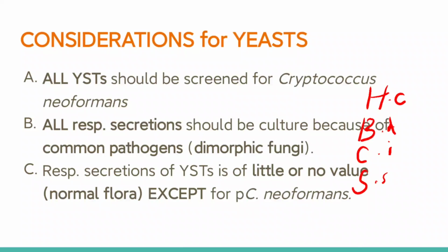Okay? So, basically, these are the common respiratory dimorphic fungi pathogens, no? So, si Histoplasma, Blastomyces, Coccidioides, and si Sporothrix. Okay? And last consideration, respiratory secretions of yeasts, no? Sabi dito, yeasts, hindi dimorphic fungi.